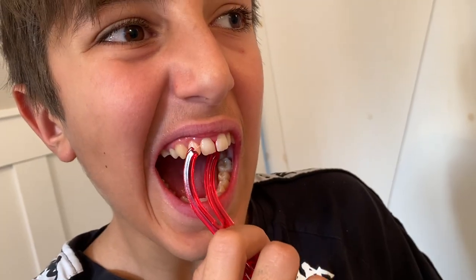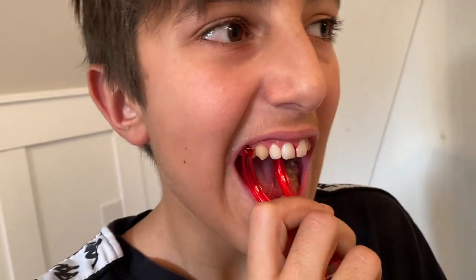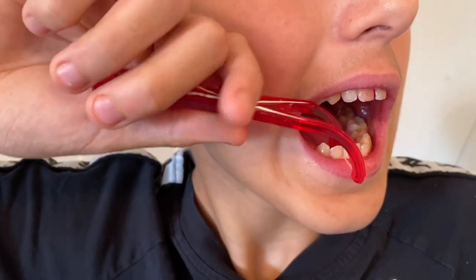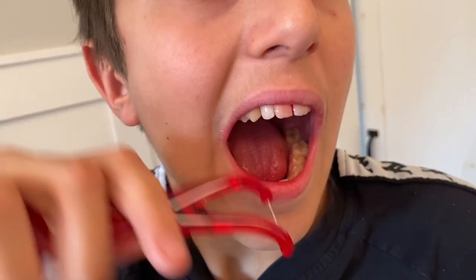You can still scrub both surfaces of the tooth using this device. You push against one tooth surface and pull against the other so that you can scrub both surfaces — whatever works to get to where you need.